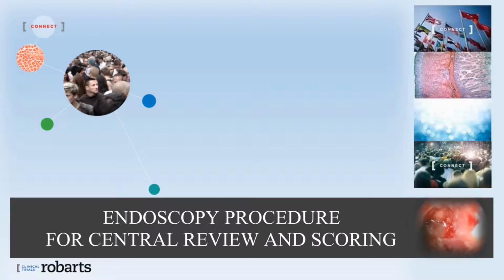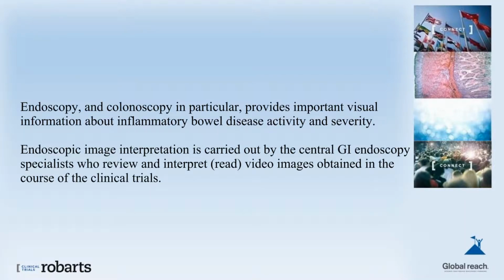Endoscopy procedure for central review and scoring. Endoscopy, and colonoscopy in particular, provides important visual information about inflammatory bowel disease activity and severity. Endoscopic image interpretation is carried out by the central GI endoscopy specialists, who review and read video images obtained in the course of the clinical trials.